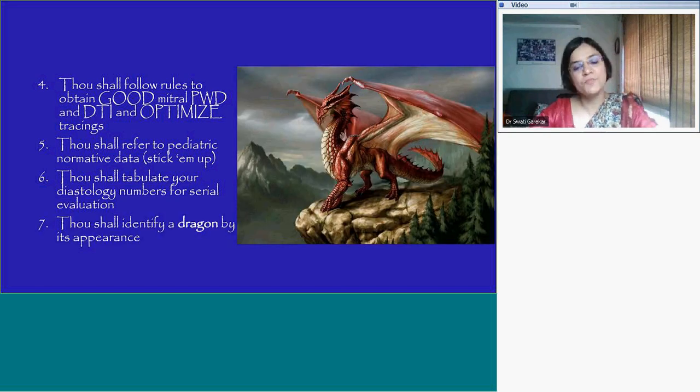More importantly, if you know the dragon, don't go out pulling out your smartphones and open up Wikipedia to find out what a dragon looks like, how many claws it's supposed to have. What I mean is, when you have severe systolic dysfunction, for example, you're going to have diastolic dysfunction. If yours aren't adding up and giving you a clear picture, there's a problem with your data, or there are things impacting how you're studying your diastolic dysfunction.